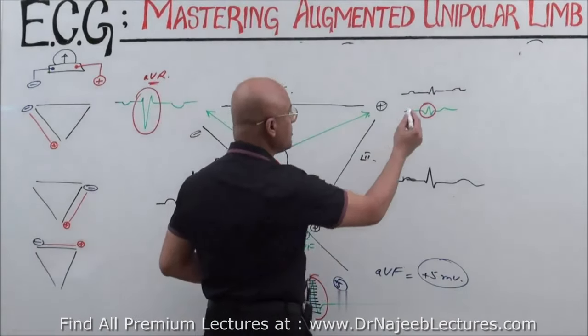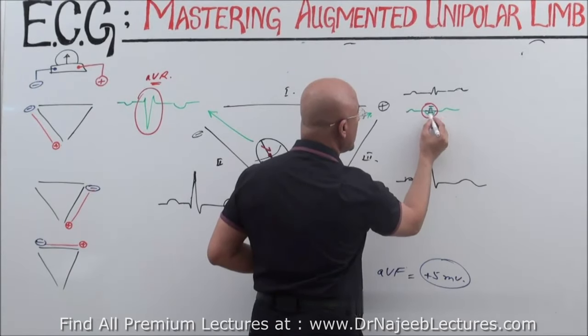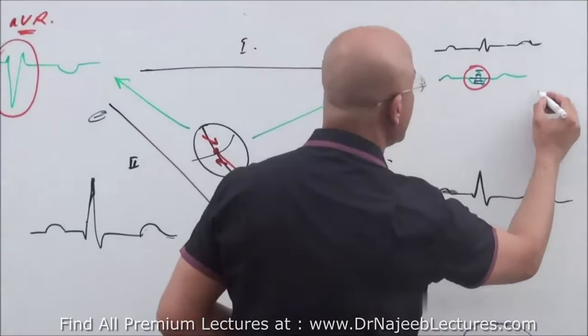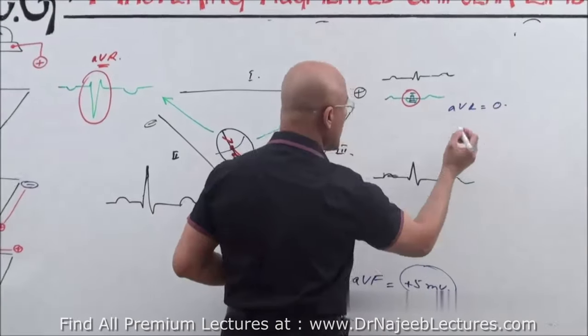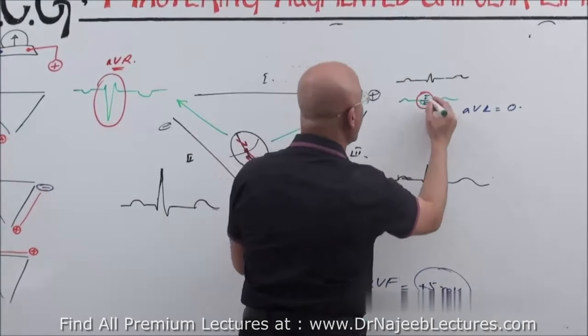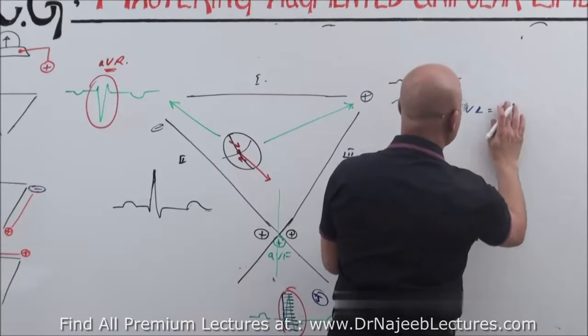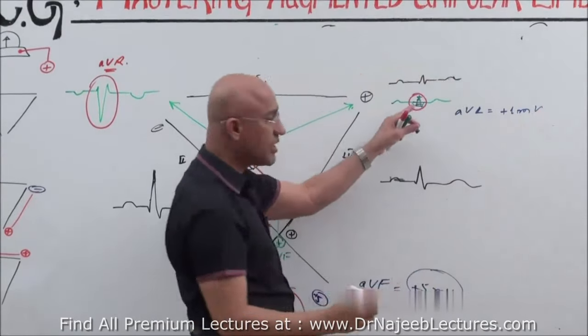Now here we come. Here it is 2 up and 2 down. So this voltage is almost 0. AVL is equal to 0. Or if I make it a little more tall, we can say it is plus 1. It should become plus 1 millivolt. Are you understanding from where it came?